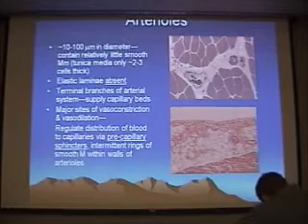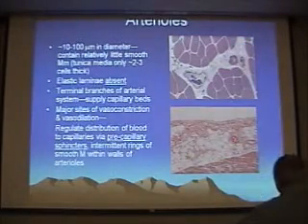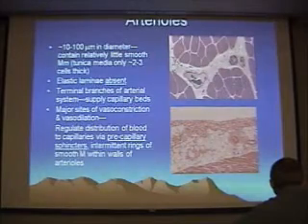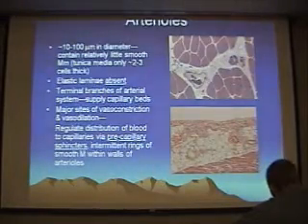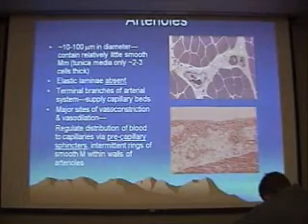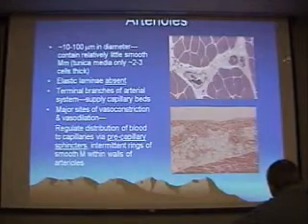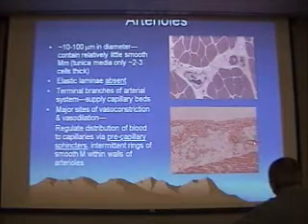In H&E, it's a similar story: you've got the intima, but in this case the vessel is constricted, so the intima is more flattened and very difficult to see. Mostly what you see is a nucleus associated with an endothelial cell. Then you see the smooth muscle of the tunica media and that looser connective tissue adventitia around it. Remember, very commonly blood vessels run in pairs — an artery and a vein, or an arteriole and a venule, side by side. And that's exactly what we have here.